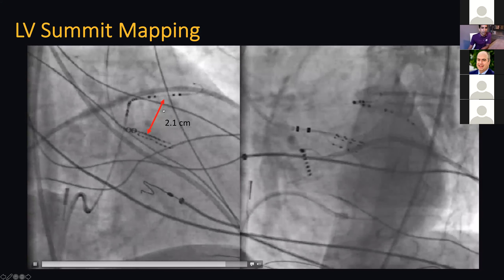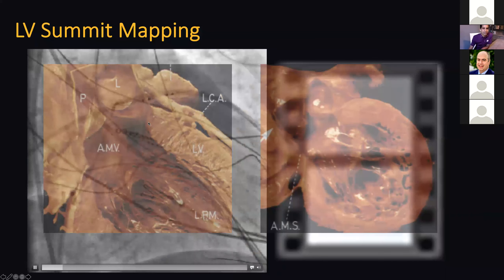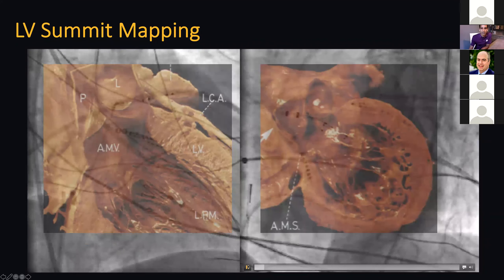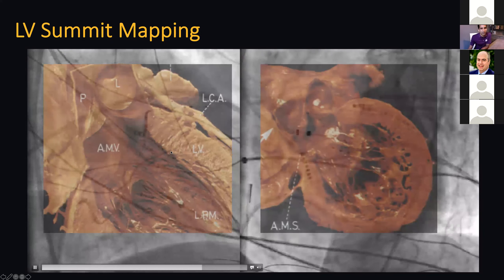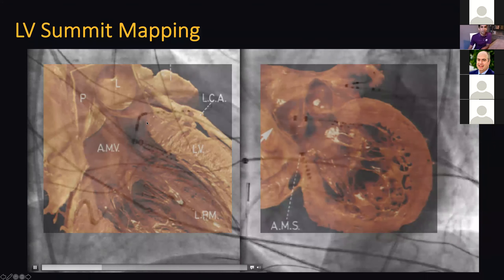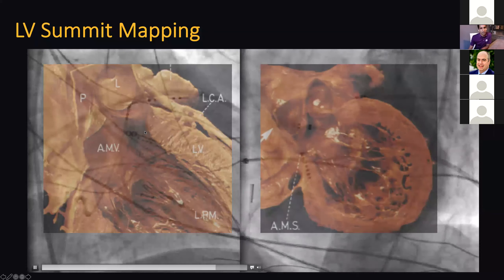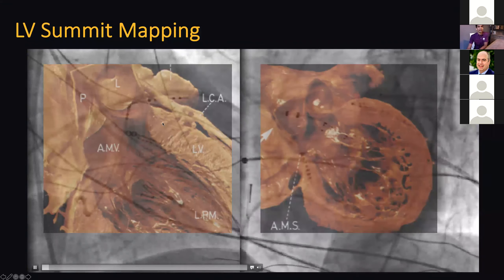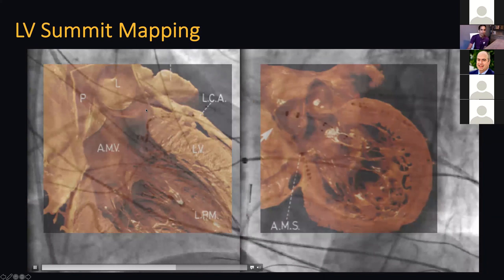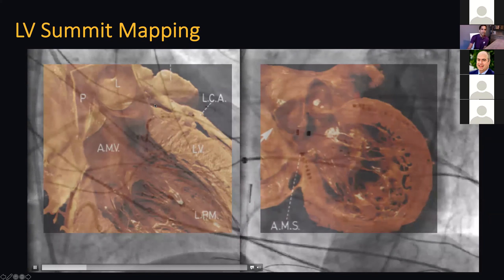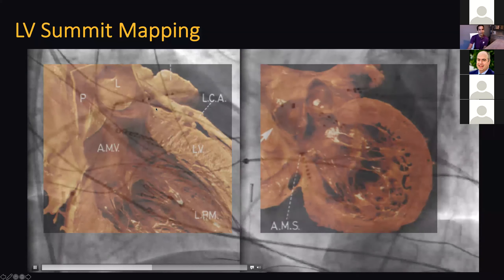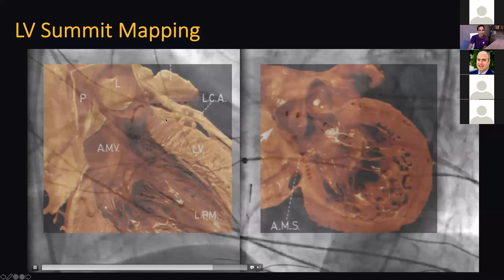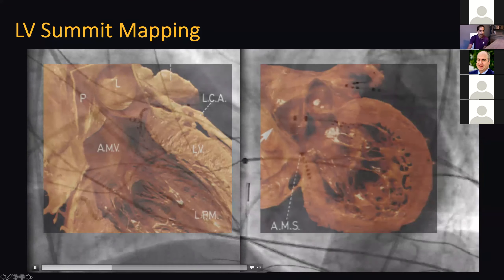I've superimposed the McAlpine images on top of the fluoroscopic images to give a sense of what you're mapping. As you come retrograde aortic, you have the HD grid catheter sitting endocardially — you might call this the left fibrous trigone — and this is the map catheter sitting in the epicardium. If your site of origin is right here, you can ablate from the base of the left coronary cusp, come retrograde aortic and ablate endocardially, or even ablate epicardially.